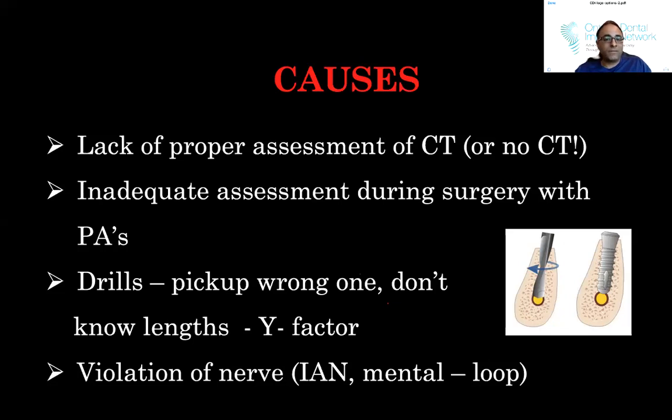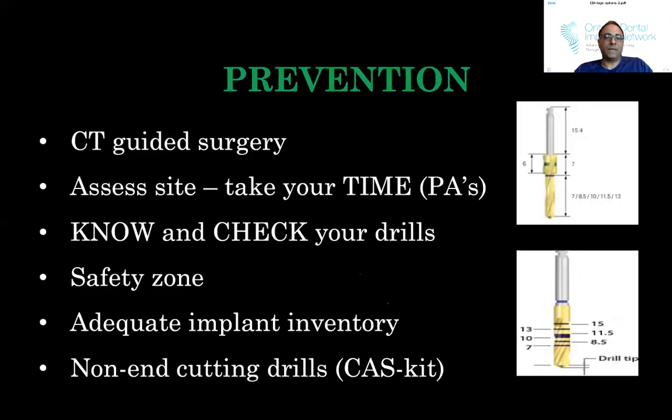You know, knowing your lengths, the Y factors, the drill tips, you need to know how long those are. And then, of course, obviously, violating the nerves. The mental foramen can have a loop. Knowing where that is is important so you don't violate it.